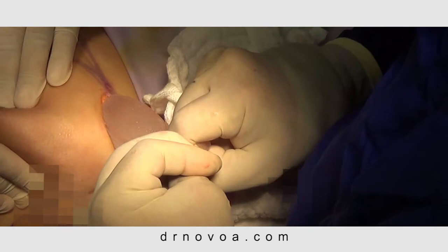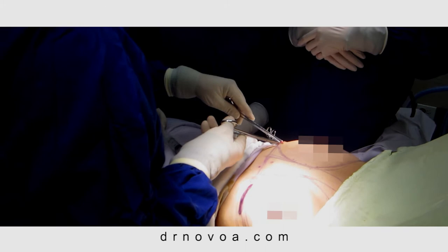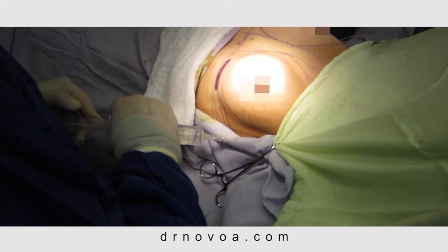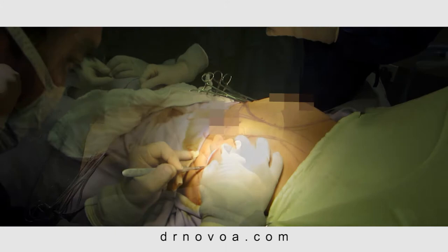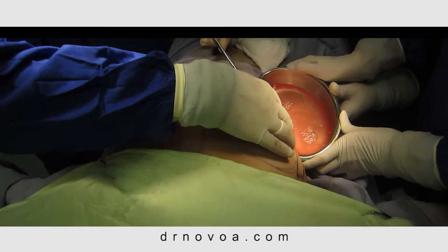An infiltration cannula is then used in the pocket and the incision is clamped. Tumescent lidocaine is then used to fill the pocket. The same steps are done on the opposite side. The implant is removed. Tumescent solution fills the second breast, and the first breast is allowed to drain.